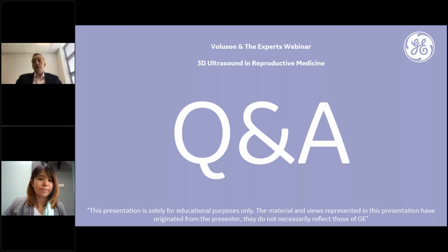Yeah, so it's a good question. So as I showed, I think what I would say is some fibroids, you're going to struggle. If you've got a very large uterus and multiple fibroids, whatever you do, the images can be very poor, and then it's going to be difficult. Sometimes in those situations, the only way to get around it is to do an MRI. But before you do that, you need to maximize your 2D and your 3D.